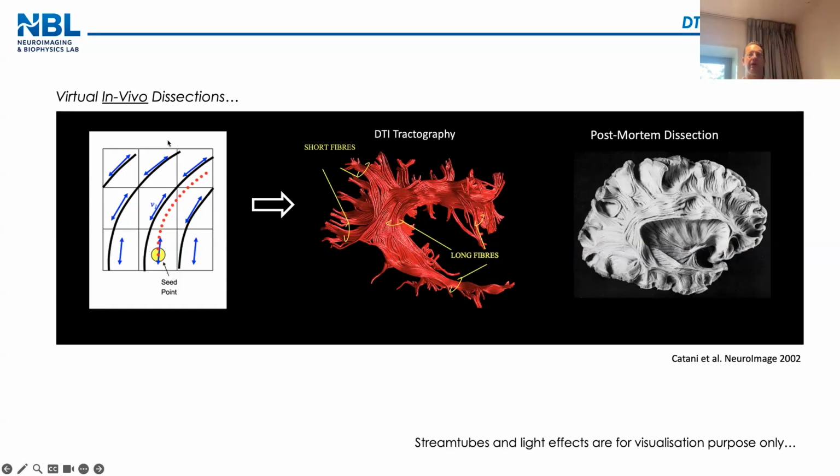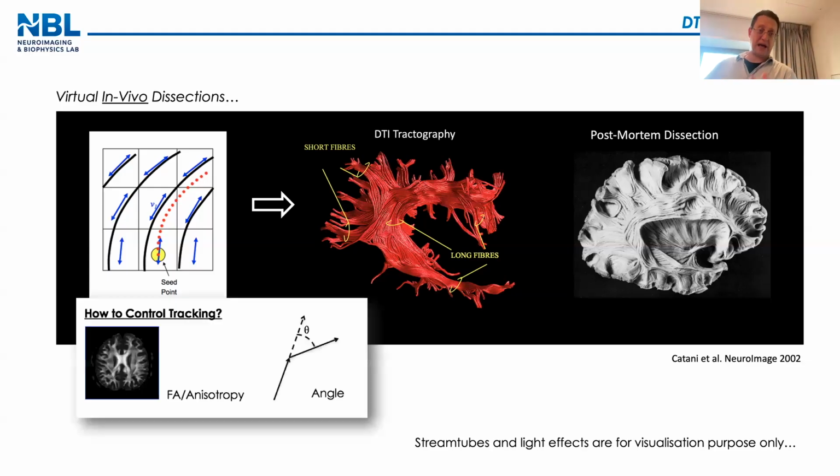So remember, with tractography, we don't see axons, we don't see fibers. We just see the eigenvector, or just that big box, 2 millimeter, 3 millimeter, that tells you the trajectory in this box. That's it. Using only this information, we try to predict the underlying real white matter orientation. Just following this instruction, we can generate a lot of streamlines, do some dissection, and this is what we're getting. This is just basic DTI with simple rules.